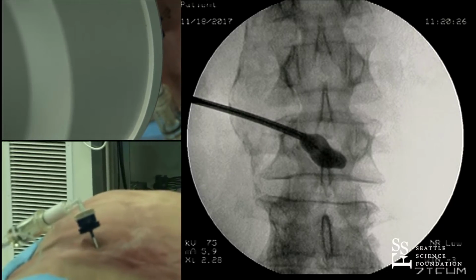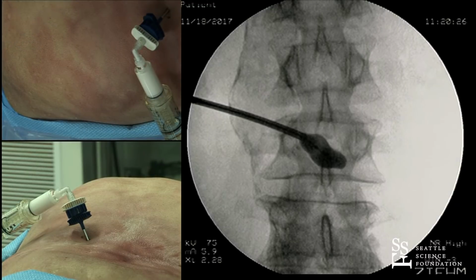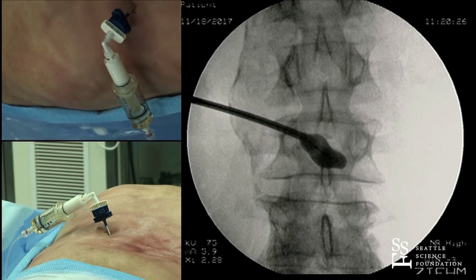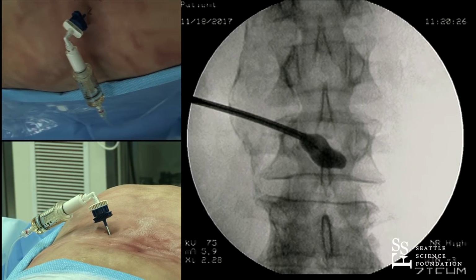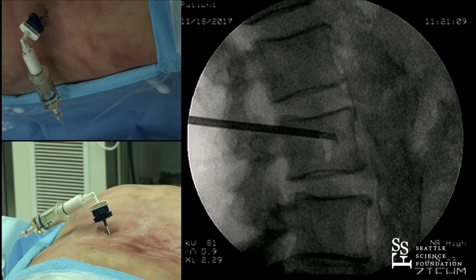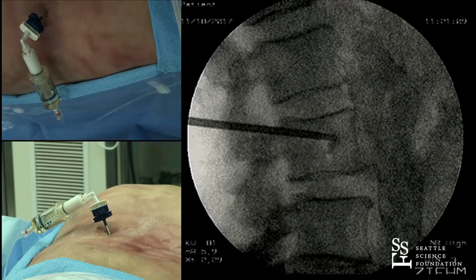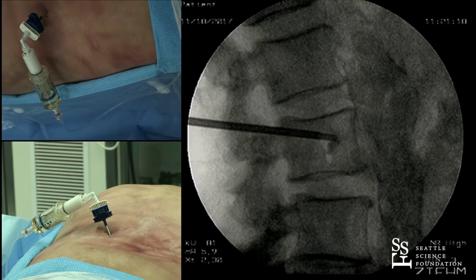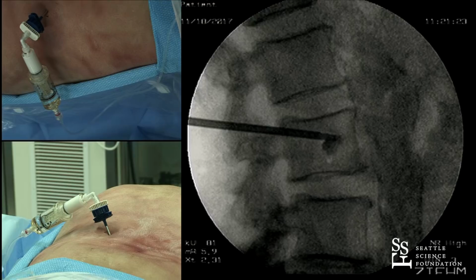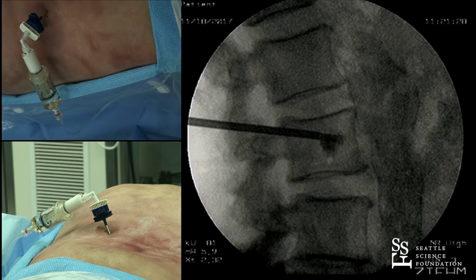On the cement injection, you always want to inject in the lateral, and you always want to watch either with spot fluoro shots or live. I would encourage you to set the pulse rate fairly low on your fluoro, and multiple spot shots is what I prefer. I do not like to have live fluoro. It just increases the radiation. Most of you will have a nice tan from radiation anyway, so you want to avoid any additional exposure that you can possibly avoid.